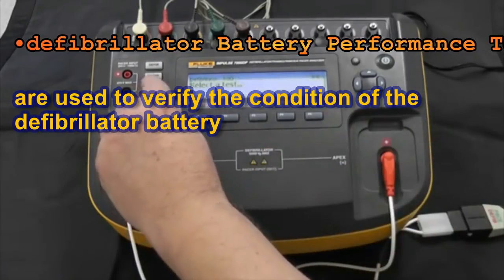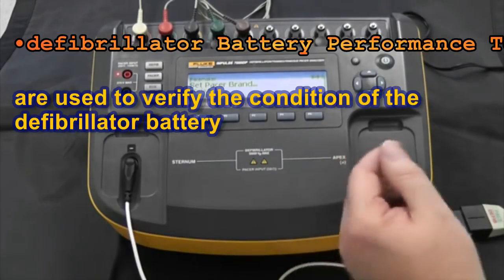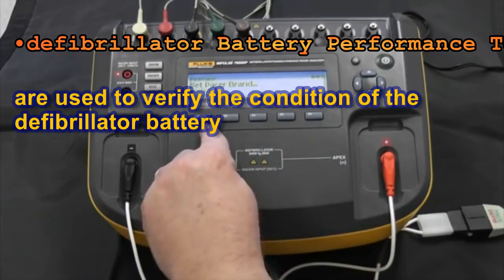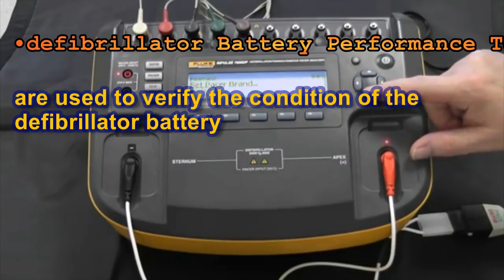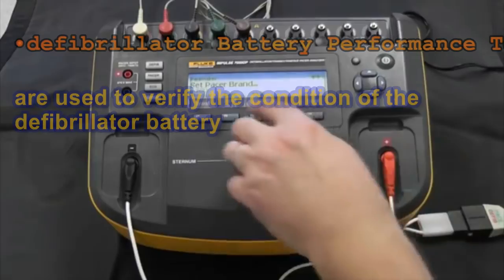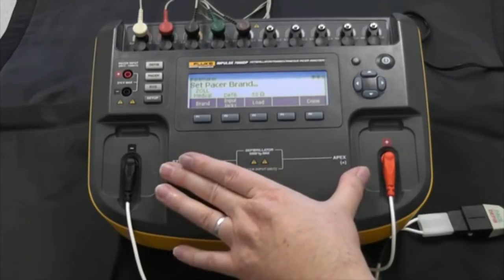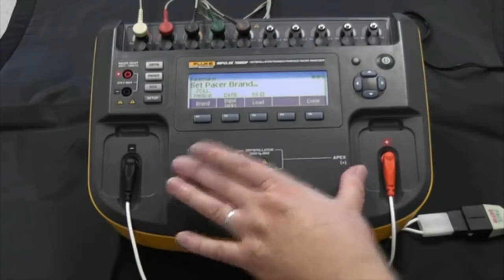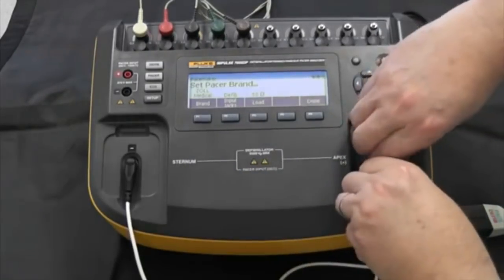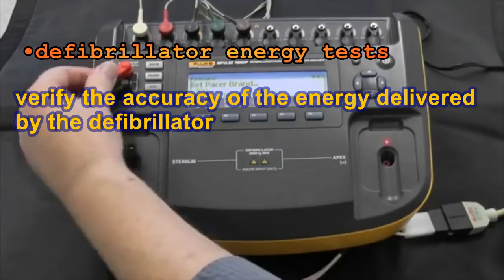Now let's pick the pacer. This is going to test transcutaneous external pacemakers that are integrated into the defibrillator. We have the ability to select the kind of pacer — we want to select ZOL because that is the pacer we have connected. If we just leave it on the defib energy inputs, the problem is 50 ohms is not necessarily the appropriate load for every brand and model. The best way is to move our connections from the 50 ohm load and connect them over to the pacer inputs.